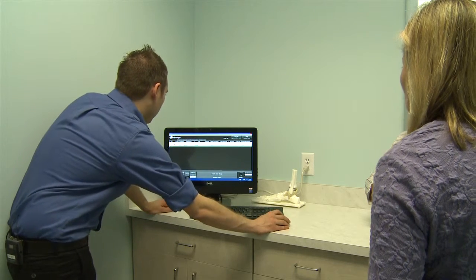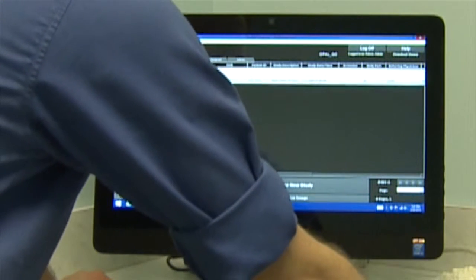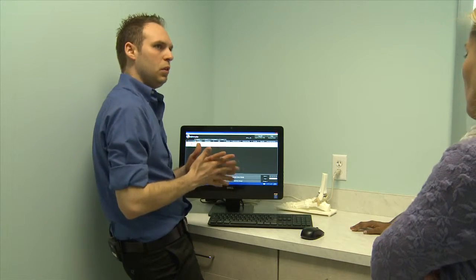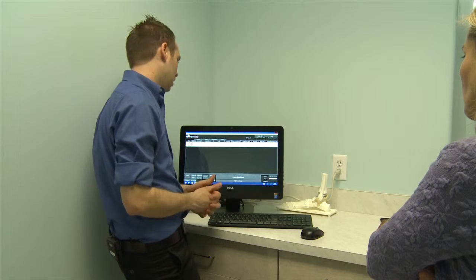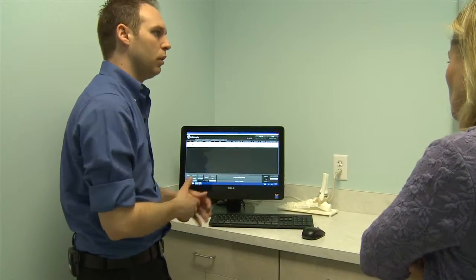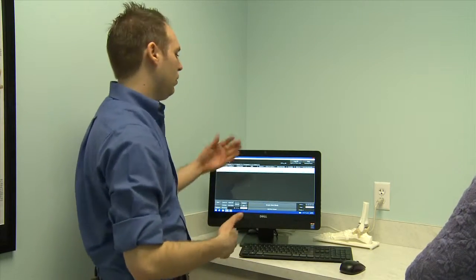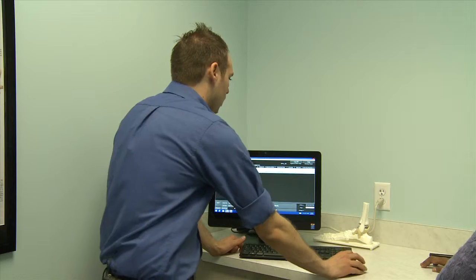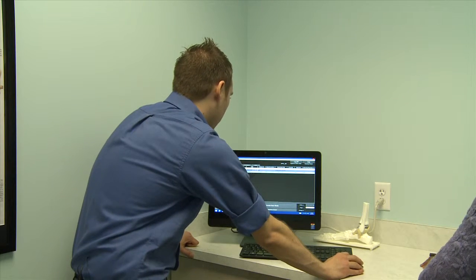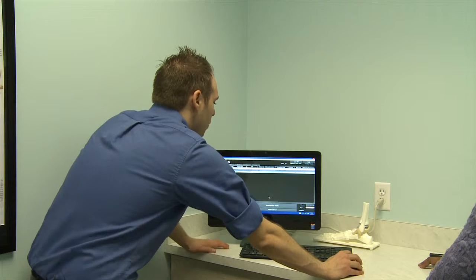There's a search bar at the top — type in a name and hit Enter, it'll filter and show results. Click All to bring everything back. There's also an Add New Image option — use this if you need an extra view or a view didn't come out correctly the same day. Do not add a new image from a study taken a week ago; always create a new study for a different visit.